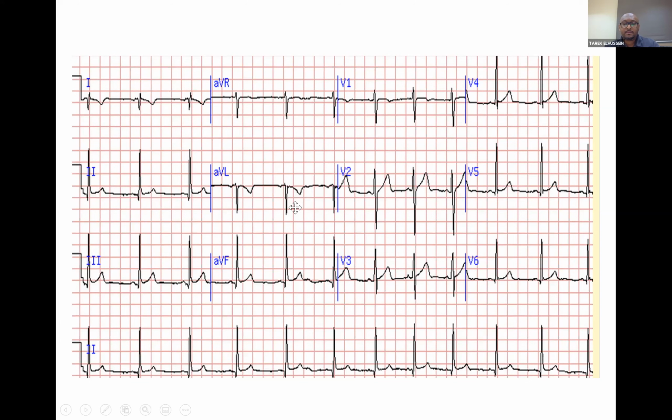Okay, thank you. So he got it right. So there is a sinus rhythm. What is abnormal here? You see this lead 1 and AVL, they don't look normal. Is it a left axis? So I have to ask myself, look at the lead itself. You can see the P is inverted, T wave is inverted. So the whole lead is upside down, okay?